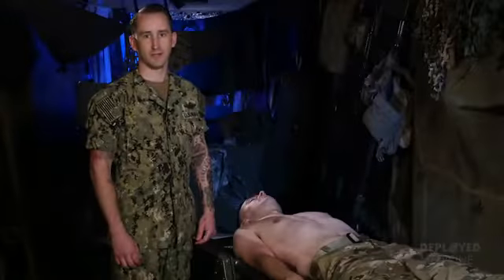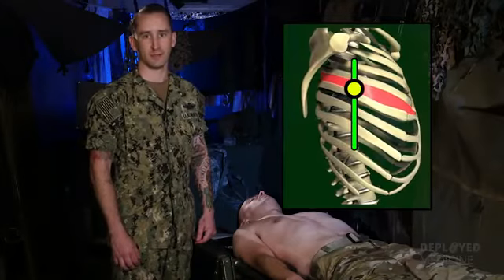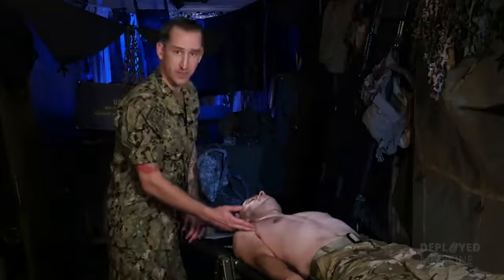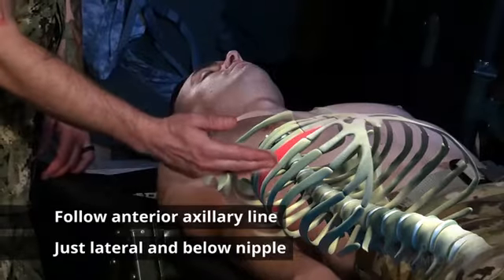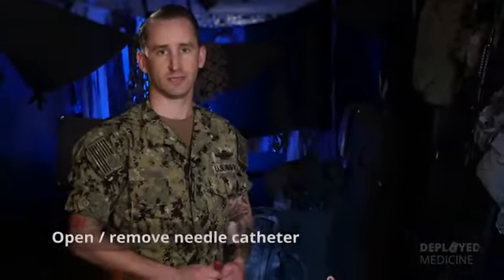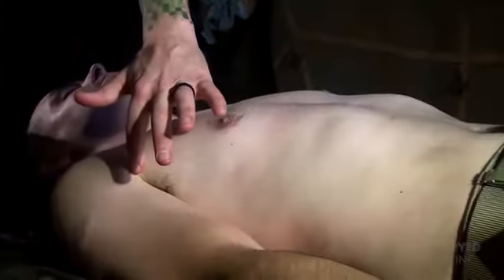The lateral site is located in the fifth intercostal space, anterior axillary line. To locate it, you're going to follow the patient's anterior axillary line to just lateral and below the nipple. Once you've identified the site, take your 10 or 14 gauge 3¼ inch needle catheter and begin your insertion.